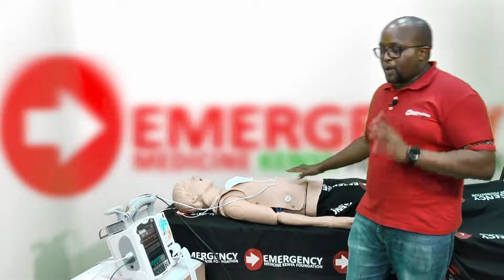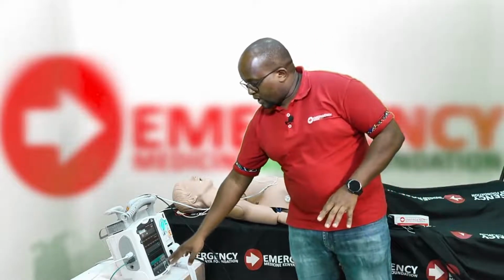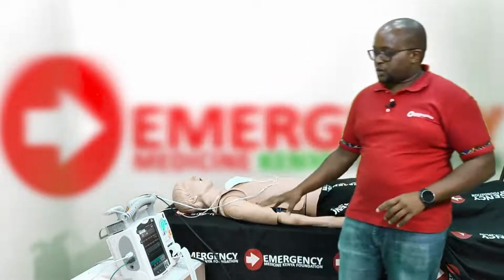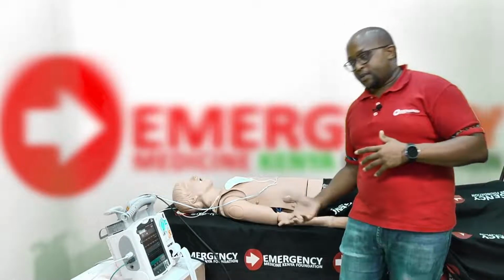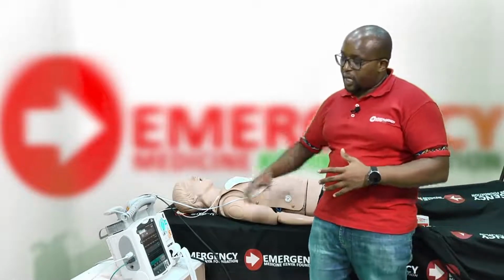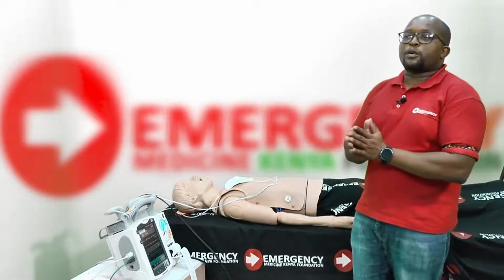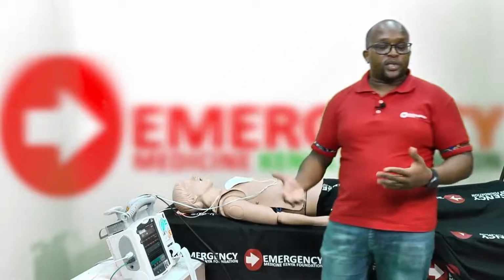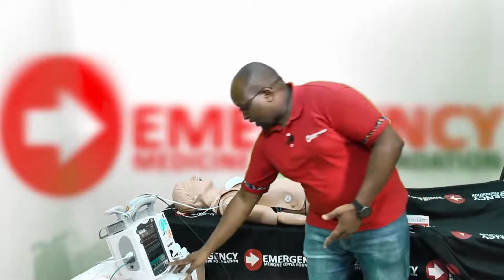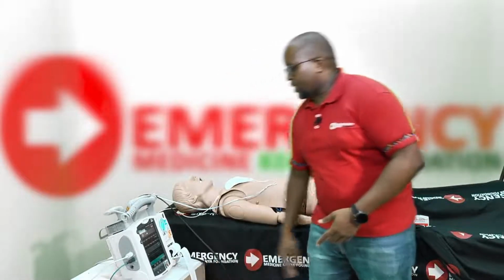Once I have confirmed my three captures, remember, this is a minimum. I got the pacer output at 70 milliamperes on this patient. So this is the minimum electricity that will give me capture. If I drop below 70, I may lose capture. So what I want to do is go up and provide a safety margin. Normally it's 10%, which in this case would be 7, but the machine only goes up by 10, so I'll go to 80 milliamperes.